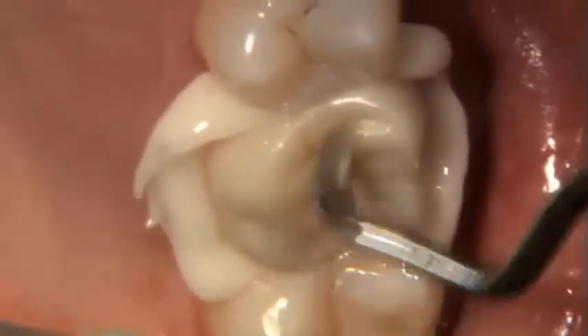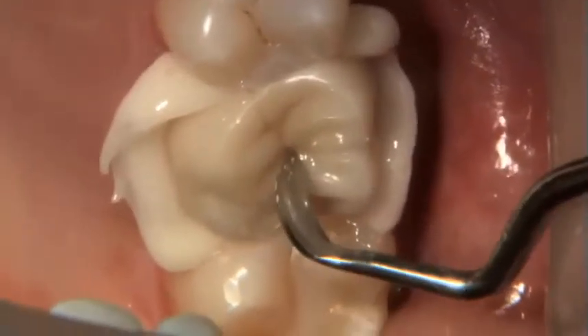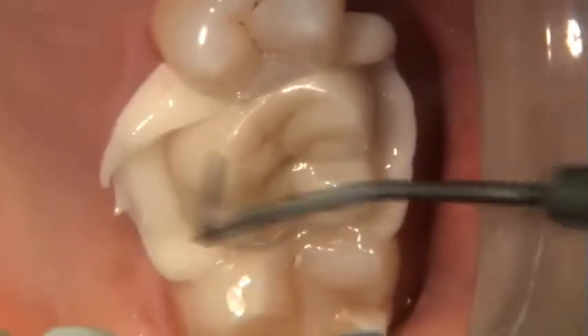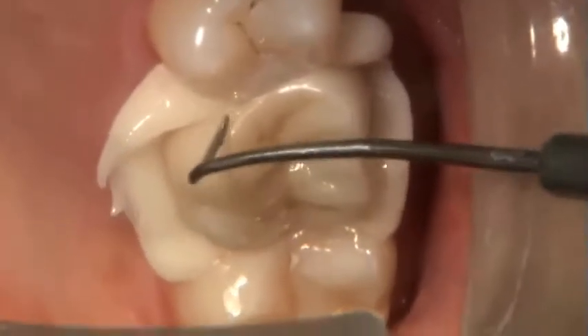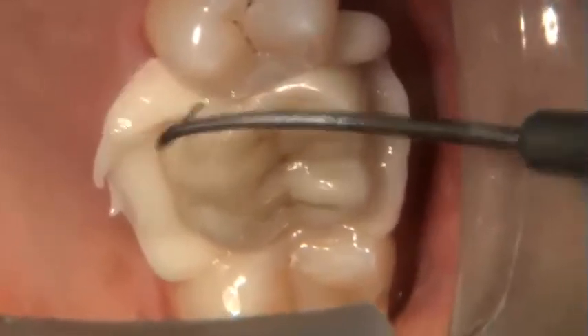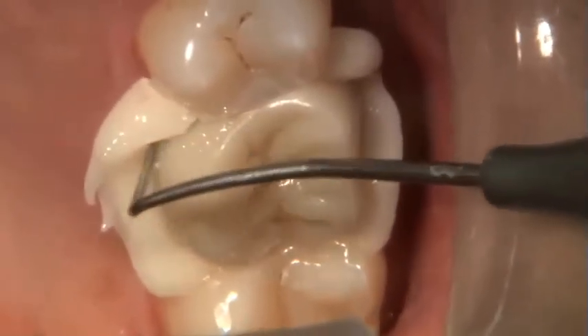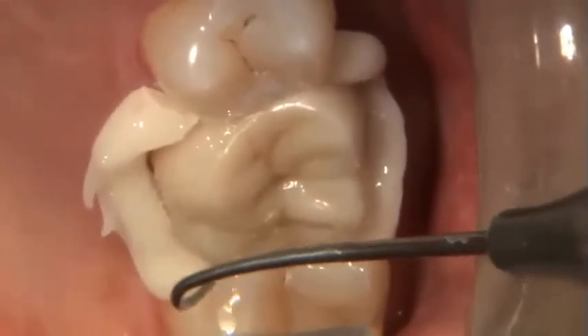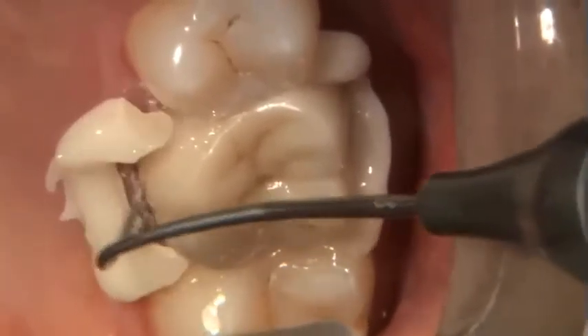So when we put the crown into place, you have two choices. You can simply have the patient bite down onto a cotton roll and walk out of the room, as you have traditionally done with crown and bridge cement, or you can light cure for a second or two. In the beginning, as you're getting used to it, you certainly want to undercure a little rather than overcure. In this one, we've just let it set up on its own, and I played with it as we were using it in each of its modes.